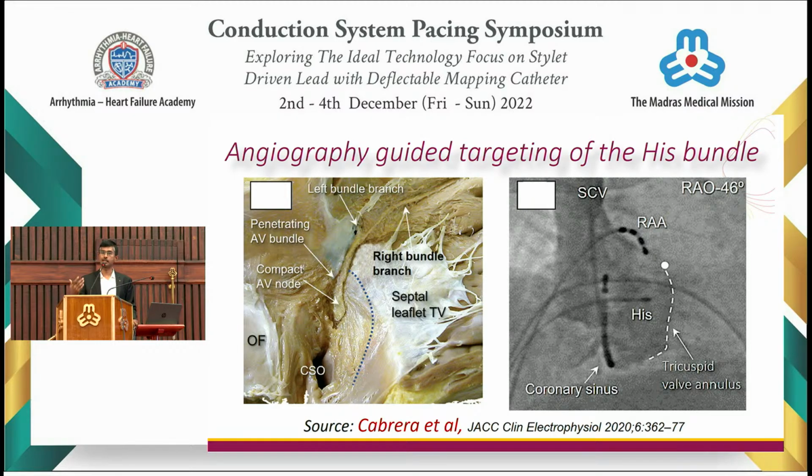But then electroanatomical mapping could also be explored. Dynamic CT on table: there are labs, Philips labs, which are equipped with dynamic CT scans, which can help us get to that membranous and muscular septum as well. But these are all investigative, and we are still looking for the best tool in addition to hunting for the His bundle pacing signals.